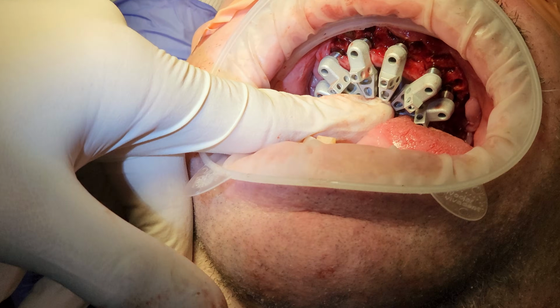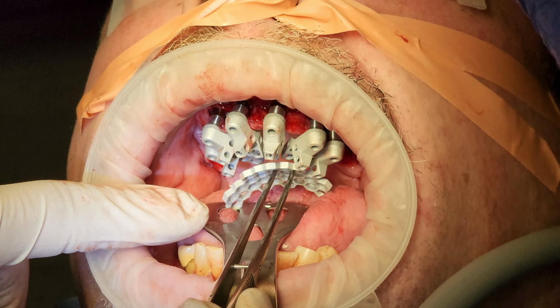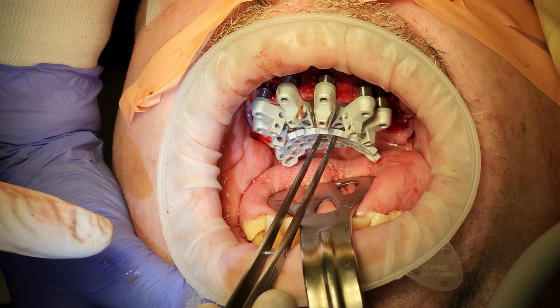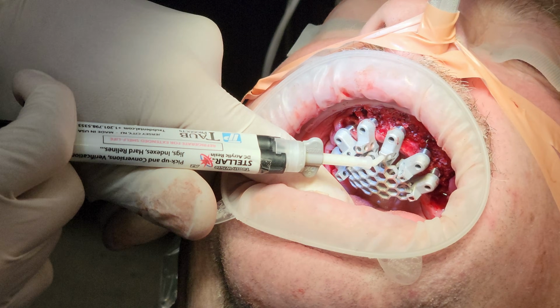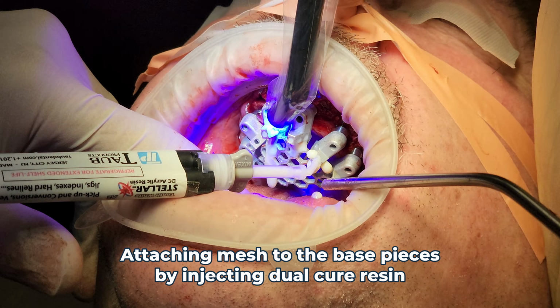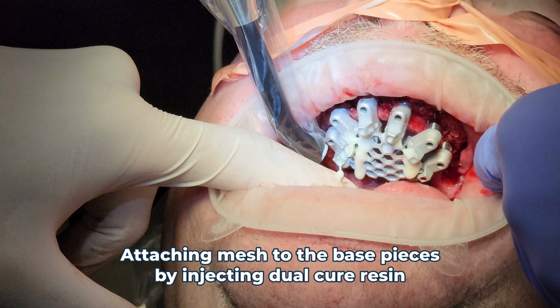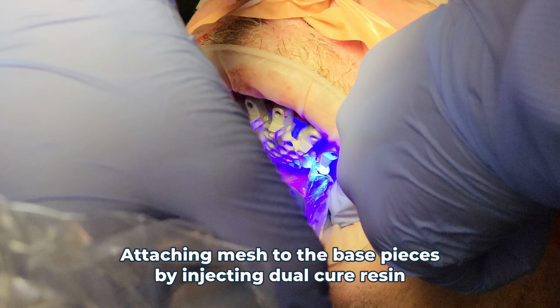So as it flows and connects the mesh to the base, we will give the resin an initial set by light curing it, but it will also set more firmly over time on its own. You need to use a specific resin for this because it doesn't shrink and keeps its exact form, so we can trust the orientation of the implants and MU abutments that this is going to register.